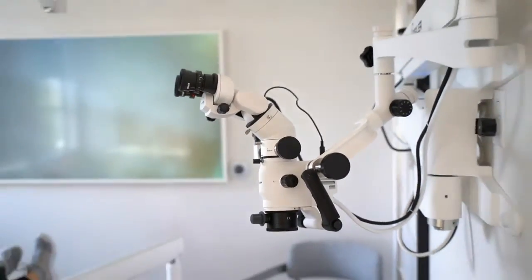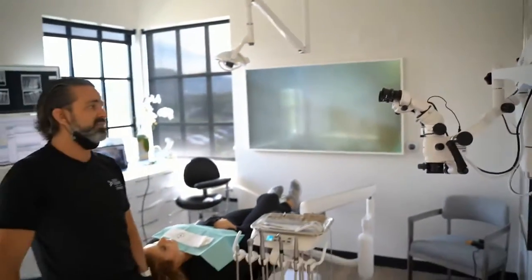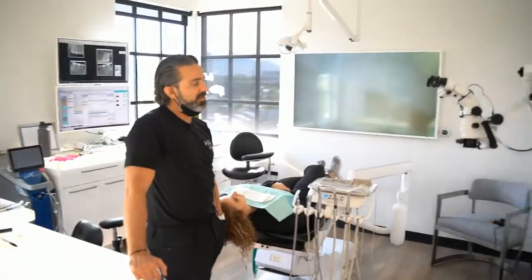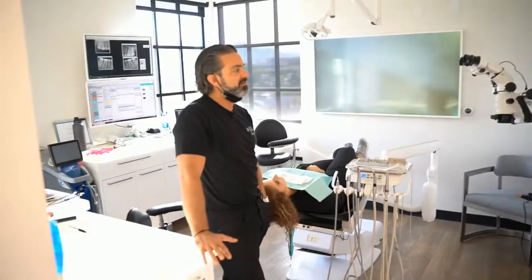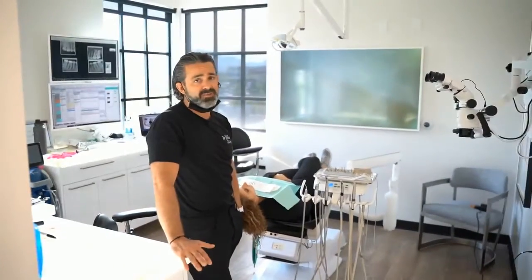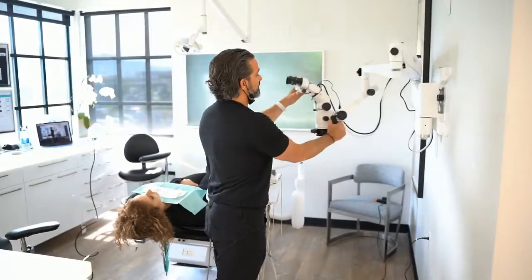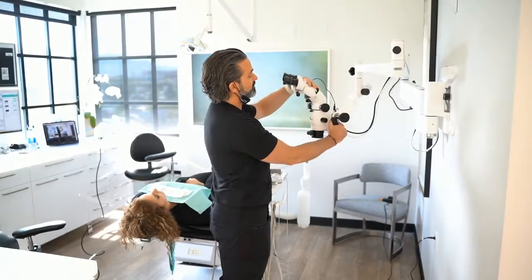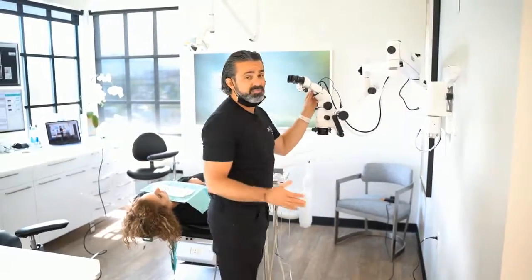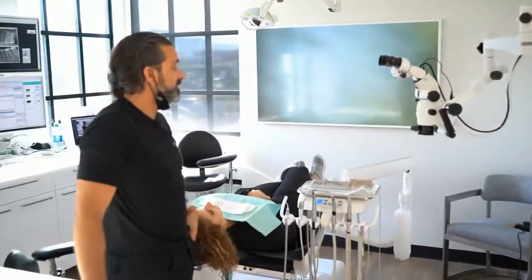I think you'll find that the more features you have to dial things in, the happier you'll be. So picking a company like Seiler that gives you a ton of configurations makes a difference. In the general dentist space, this ability to cant your oculars is really important if you work off center, off a patient's head.